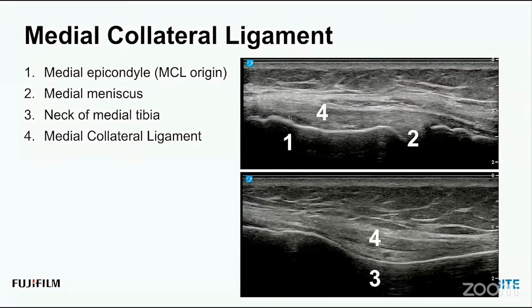Same shape, same geometry. Imagine that same ligament jumping over the humeral ulnar joint. In this case, we have the medial aspect of the knee joint where the femur and the tibia meet. Same shape, same appearance. Then it's going to drape distally here. Coincidentally, we do see a little bit of the enthesis of the deep component right here because this is a Sonosite PX image, very high image quality. And then superficially, after the deep component inserts, the superficial component still keeps going. Here's that medial neck of the tibia.